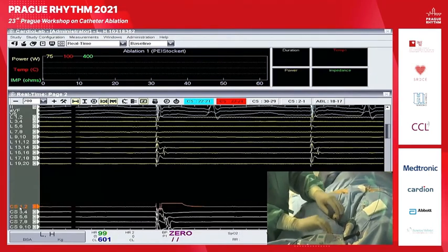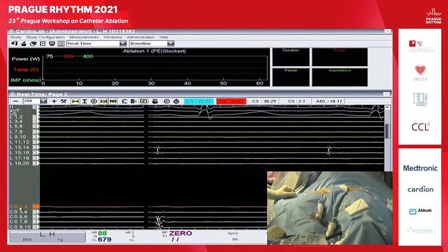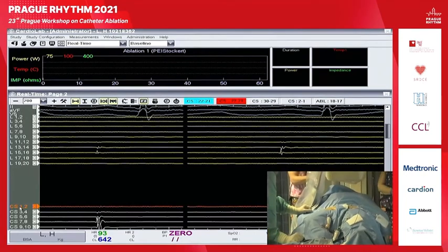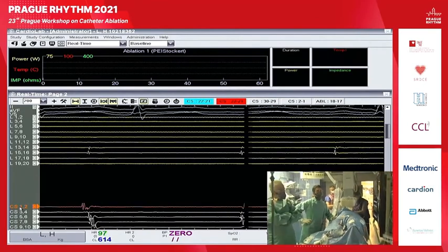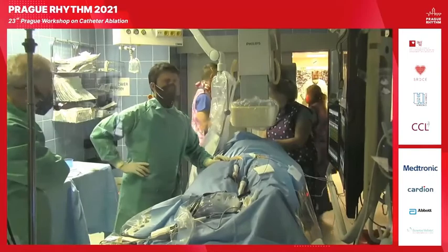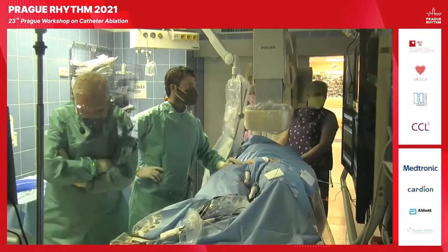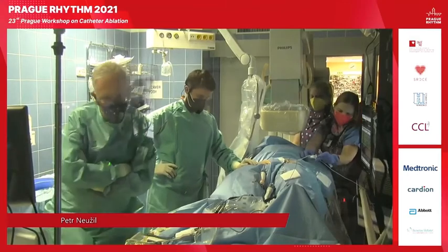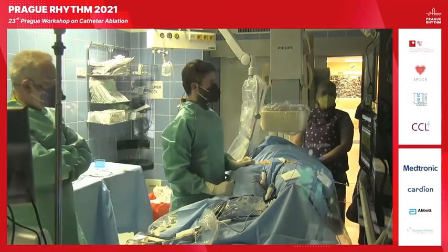So actually, we are going to move to other lab. So, do you have any questions, Peppa or Robert, about? How often after ablation you must go back with a balloon if there are one vein or more veins not isolated? Actually, it's very good question. We like to go with the same balloon. So actually, the touch-ups with RF. Actually, if you follow all these studies we publish, and actually Boris is very active. So Boris published. So the touch-ups are very infrequent. So we try to get with the laser.